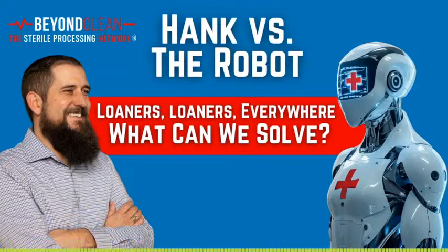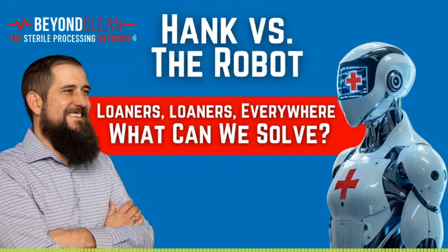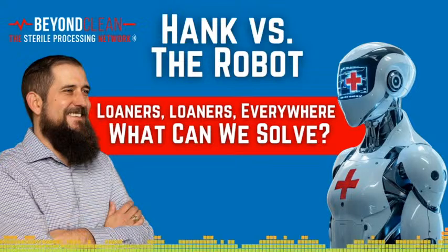To fix this, we need tighter contracts and service level agreements that enforce penalties for late or incomplete trays. Better yet, technologies like real-time tracking and predictive analytics could help both vendors and SPDs anticipate and mitigate these timing challenges before they become crisis points. Yeah, a lot of work has been done on that predictive analytics piece. A lot of companies now in the market trying to bridge the gap.